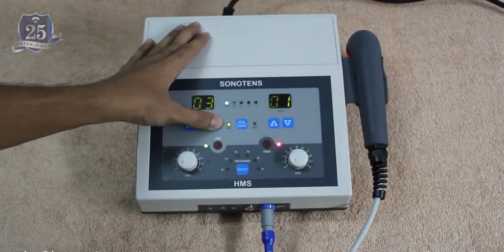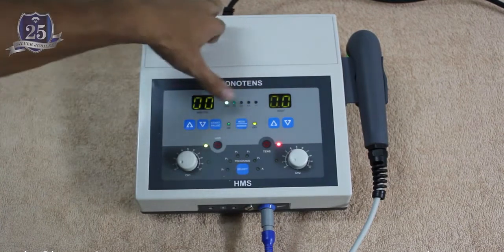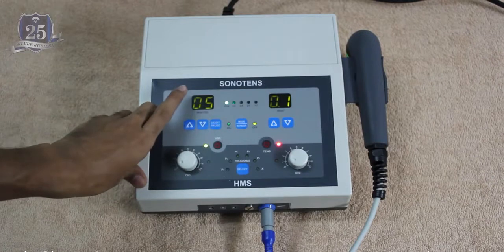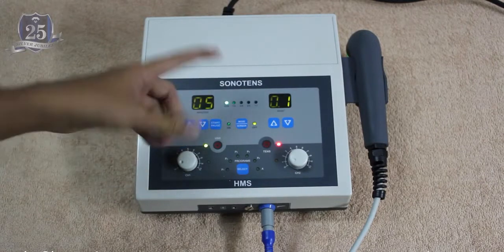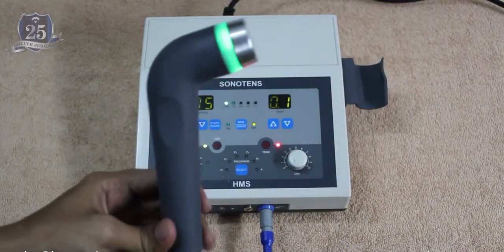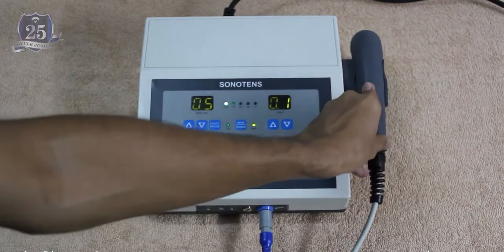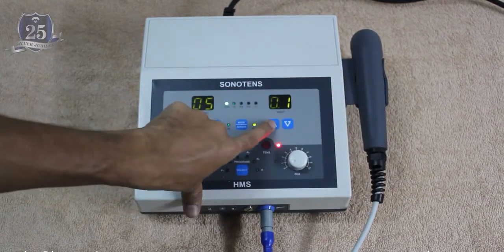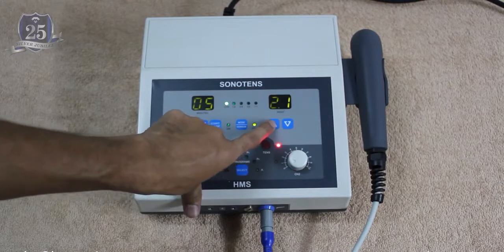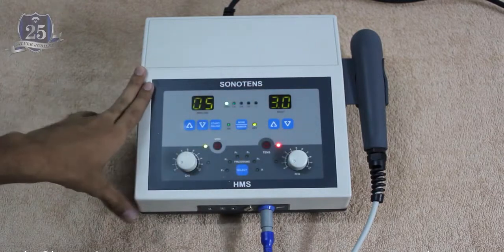So now we'll switch off the auto sensing mode. I am switching off the auto sensing mode now, and now I'm setting up the timer. I'm starting up the machine. So the machine is now started. You can see the green light glows over here, the transducer. So now the machine is in the on state. Now this switch over here is used to increase the intensity. Maximum intensity level is 3 watts. So this is the maximum intensity level.